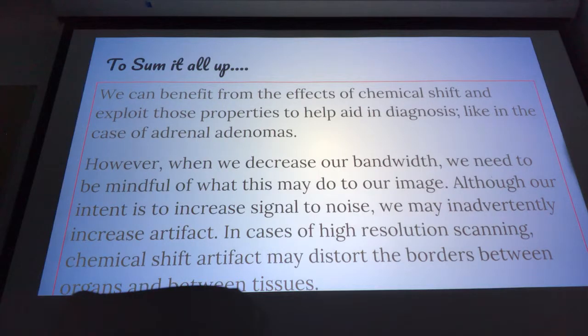However, when we decrease bandwidth or play with bandwidth, we need to be mindful of what this may do to our image. Although our intent is to increase signal to noise, we may inadvertently increase the artifact. In cases of high-resolution scanning, chemical shift artifacts can distort the borders between organs and between tissues.